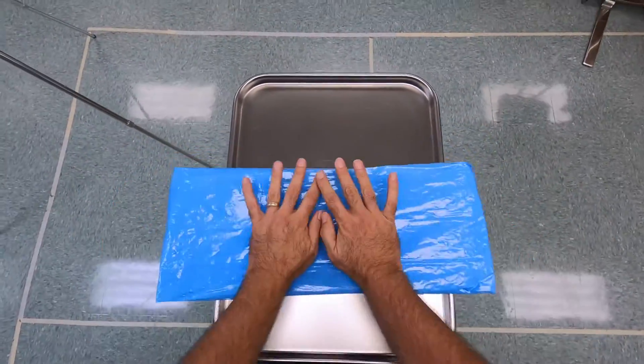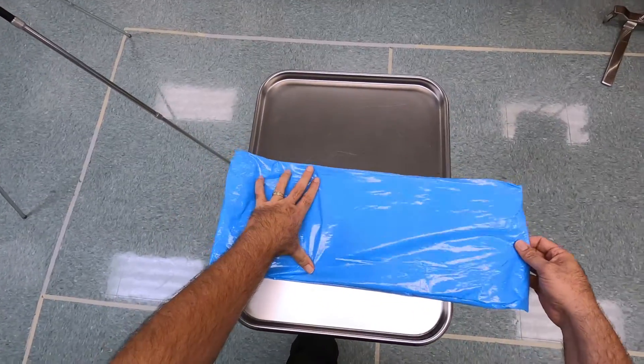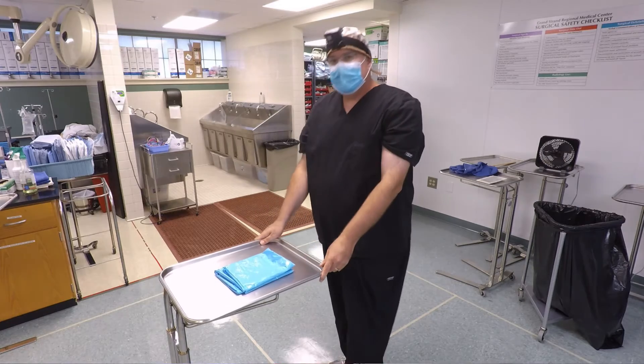Straighten all this up, push the air out again — I like to push that air out of there. And then I'm going to do a fold here and a fold here. And now our Mayo stand cover is folded.